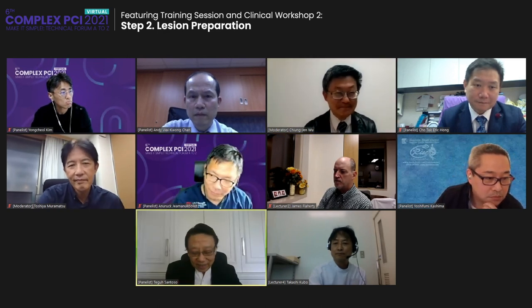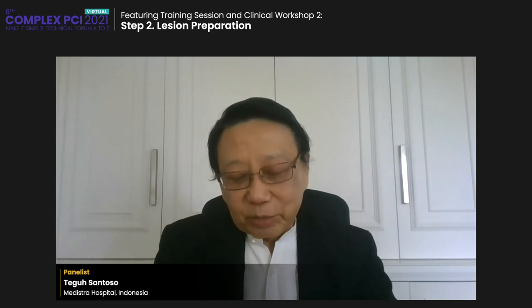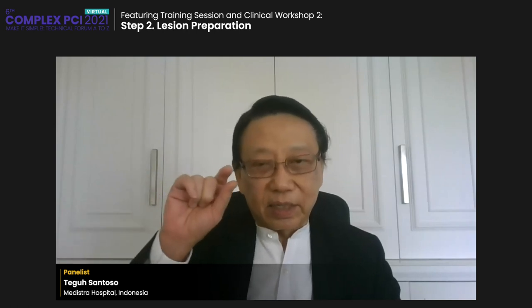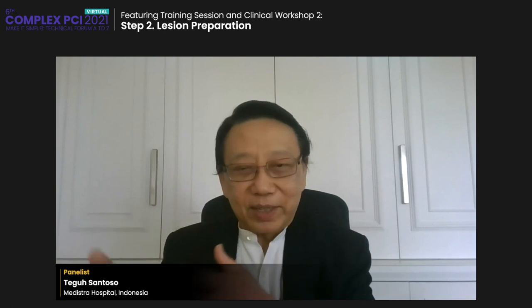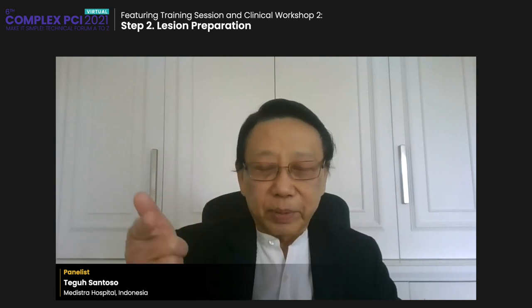I think we have heard a very good lecture from Ajay, and I just want to complement his recommendations. We know there are plenty of algorithms for how to treat calcified lesions. If the lesion is severe, we can also use the calcium scoring system using OCT, as mentioned by Ajay. There is also another calcium scoring system using IVUS. If the lesion is severe or balloon uncrossable, then usually debulking is recommended, with either rotational atherectomy or orbital atherectomy. In my hospital, I use both.